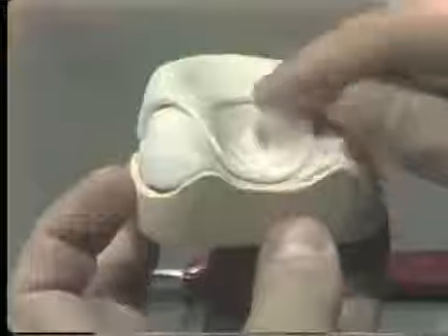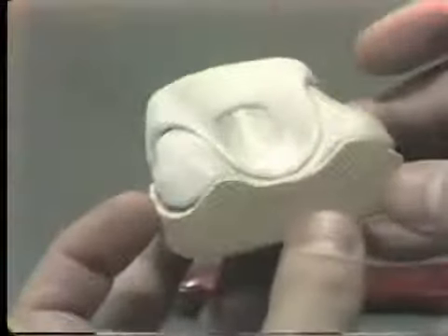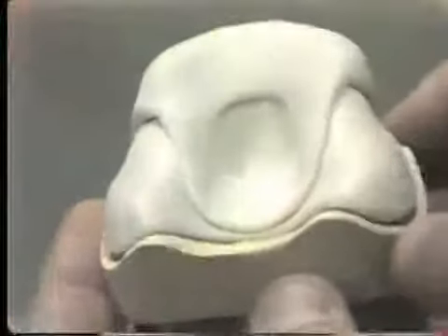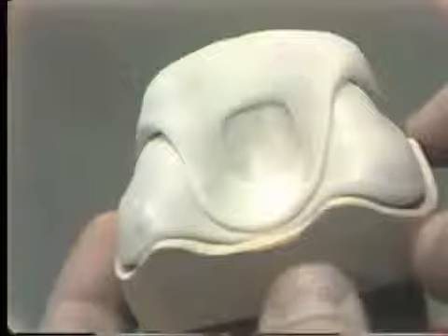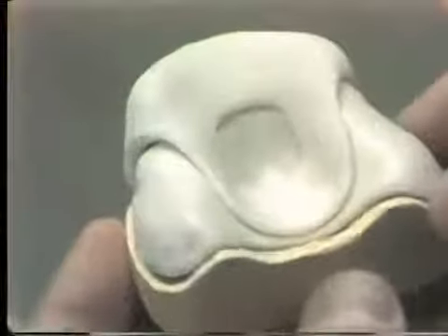I have cut a hole in the center part of this second tray so that when this tray is seated in the mouth, you can see that the tray is seated properly. If you don't cut that hole out or have some other means of determining that the first tray is indeed seating properly in relationship to the second tray.